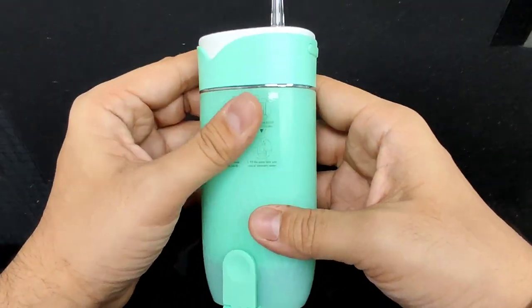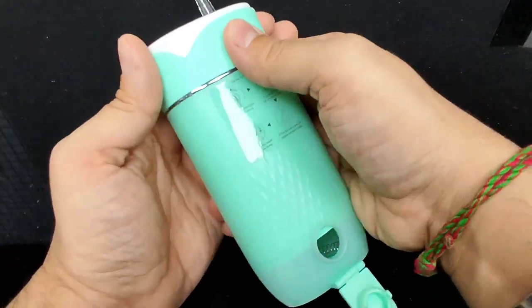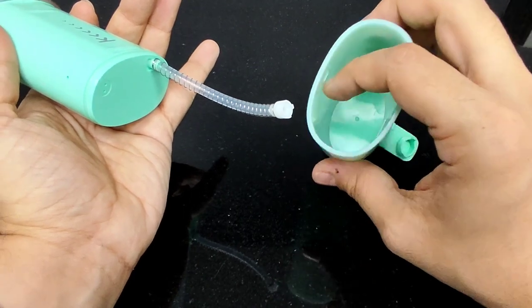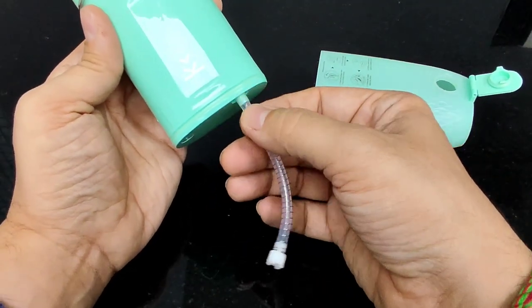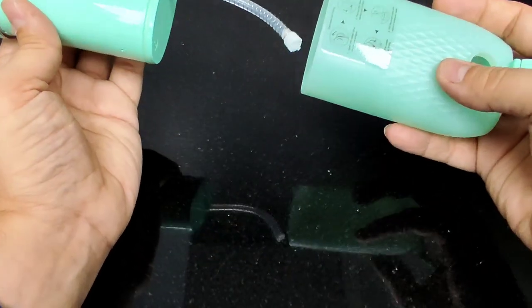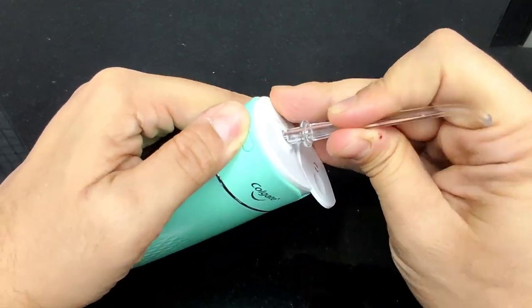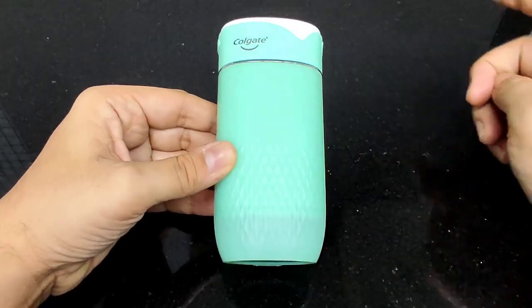In my personal opinion, Colgate has done an absolutely amazing job with this system. One very important thing they've catered to is how easily you can clean it. As you can see, it dismantles so I can clean the inside thoroughly — I'm very careful with my personal oral hygiene, and I know many others are too. The tube can also be detached, cleaned, and placed back, meaning hygiene has not been compromised in this design whatsoever. The compactness and the cuteness of the delivery system have also not been compromised.